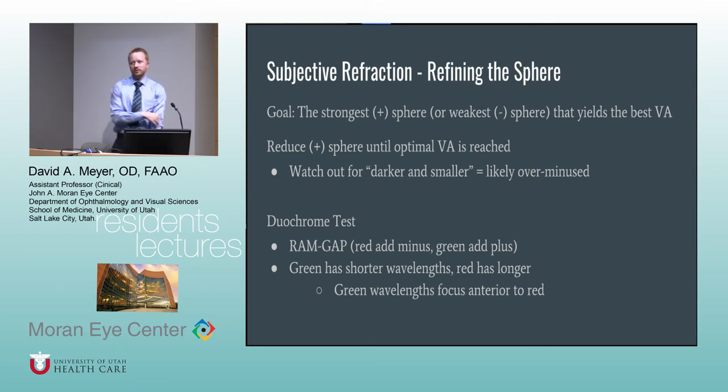Especially kids. Kids will eat minus. They'll eat tons and tons of minus. Their actual Rx is like a minus two, but you're giving them minus three and they're like, oh, I love this. This is really sharp and clear. That's just because you're over-minusing them and they like that dark and clear appearance of the letters. But ultimately, that's not going to do them any good. They're not going to like that.